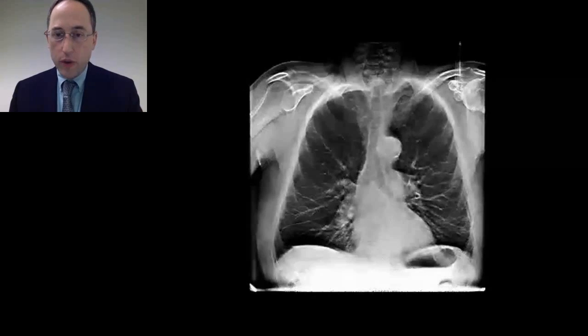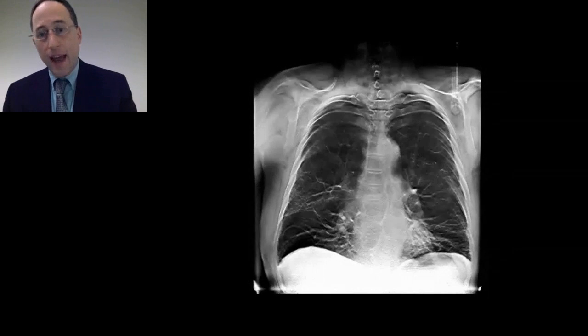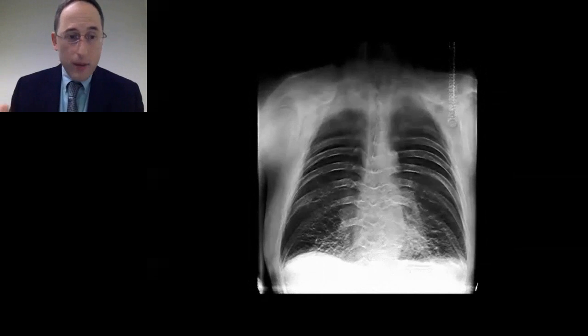We're scrolling through our tomosynthesis stack. Now, these are very high resolution images. They're chest x-ray resolution, which in general are 2 to 3 megapixel images. And you have to keep in mind that your monitor is probably only, if you have a good monitor, a 2 megapixel monitor, you're using in a web browser, you're seeing a fraction of the true resolution that this study has.